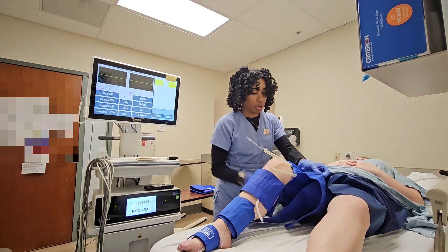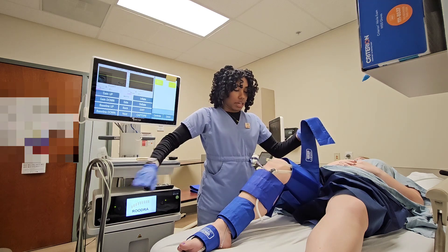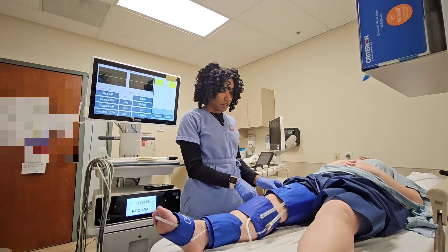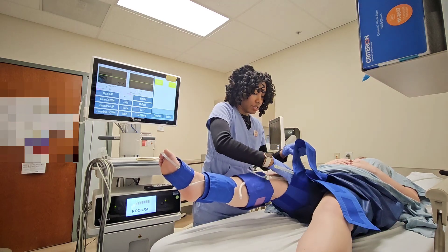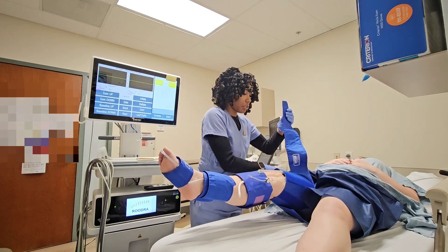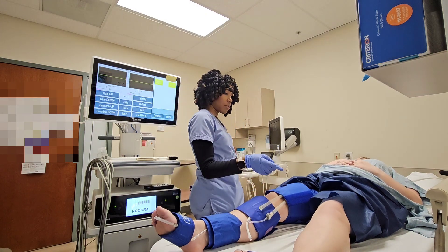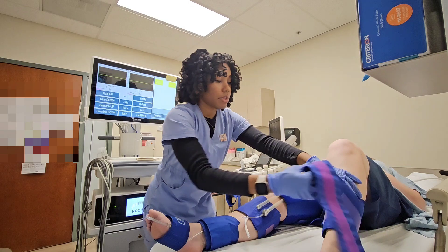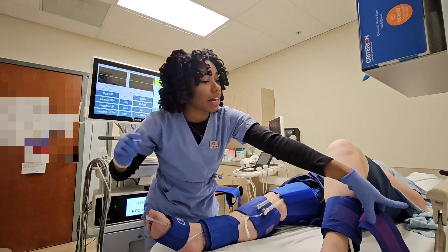I get the cuffs on one of two ways — I'll wrap them around like this. Get it nice and snug because once the patient straightens out the leg, it's going to get looser. I don't want the cuff on the kneecap. Can you straighten out that leg? Now bending at the hips, not bending at my back — ergonomics, guys. Got to save our backs. Use your core.